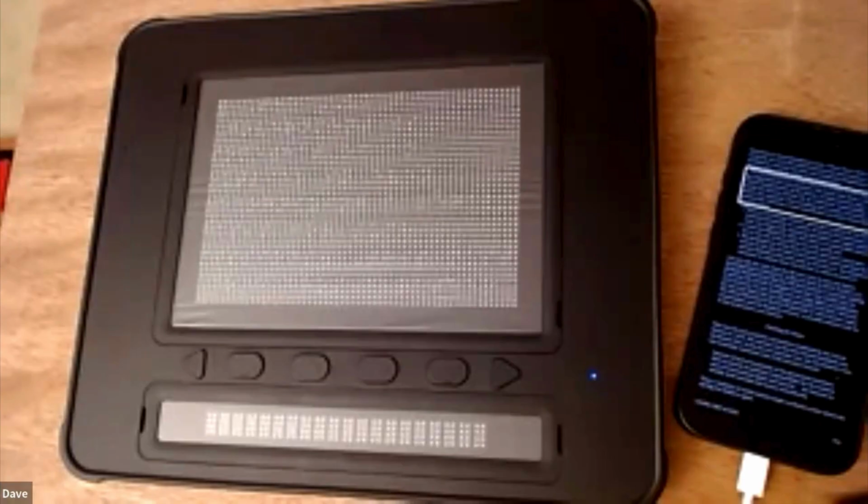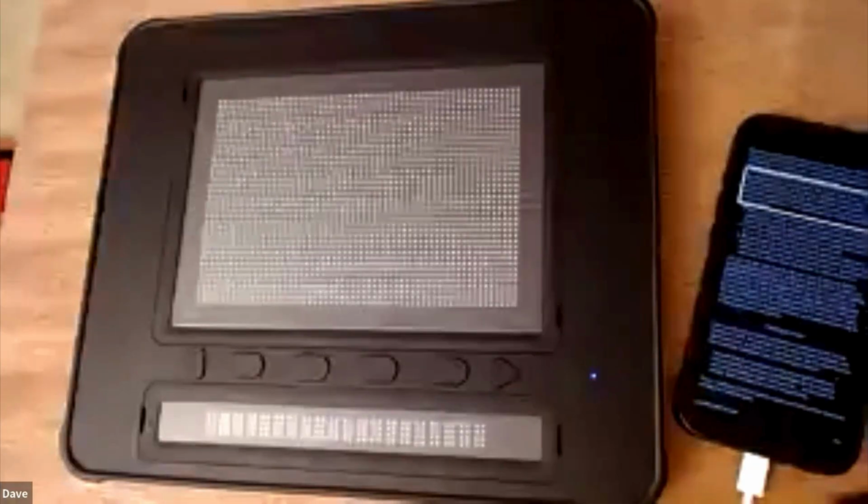So I'd be interested to know which reading app you're using and how you're getting on, and whether you've had a chance to try that with multiline Braille. So that's a little bit of a recap. Make sure that your device is obviously charged and that the Bluetooth is on. I recommend switching on the dot pad before you unlock your phone to ensure reconnection.